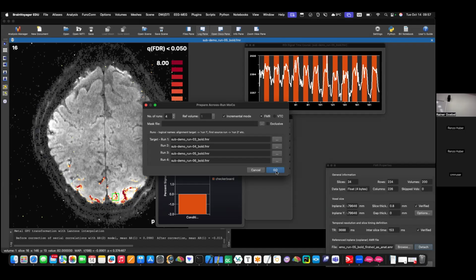But it's not so important because you can change your reference when you do the actual motion correction. It's just for preparation. And then usually the first volume is nicely T1, more T1 saturated. It's actually good to use the first one for this. It's not the actual motion correction. It's just a cross-run motion correction, the first volume, right?